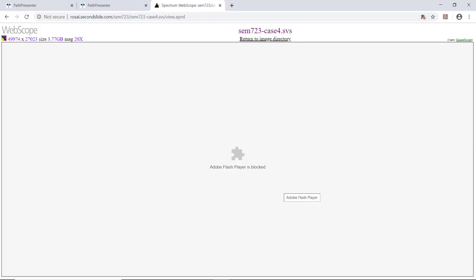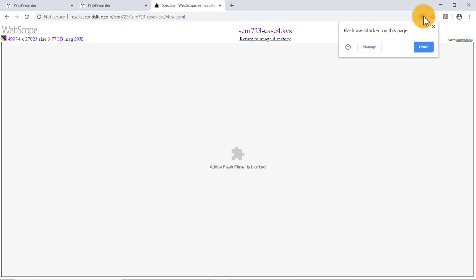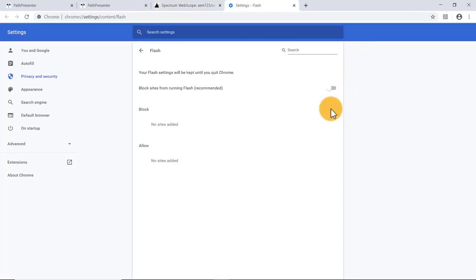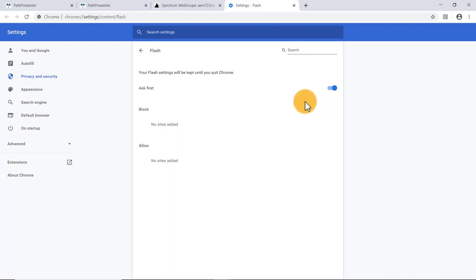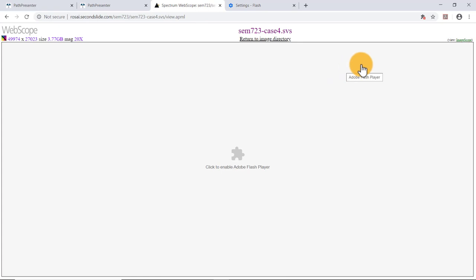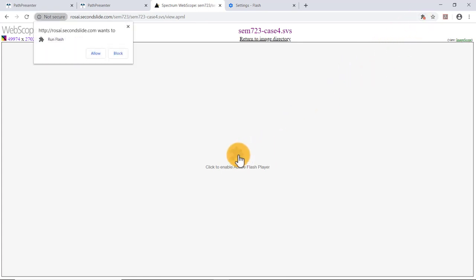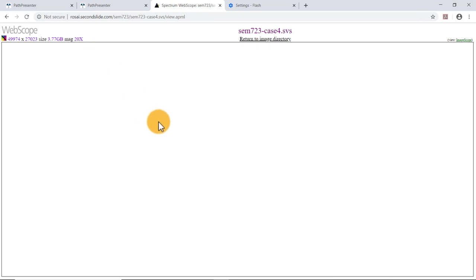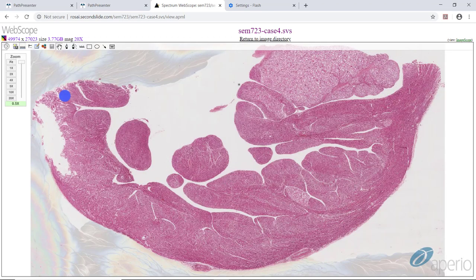For the histologic section on case two you will have to copy paste the link. In addition you have to install Adobe Flash Player. After enabling it, this time it allows me to look at the slide. You can see this is a whole mount section of the heart. This here is the ventricular wall and there are numerous tumors — there's a large one right here, there's a smaller one right here, and a smaller one right here.